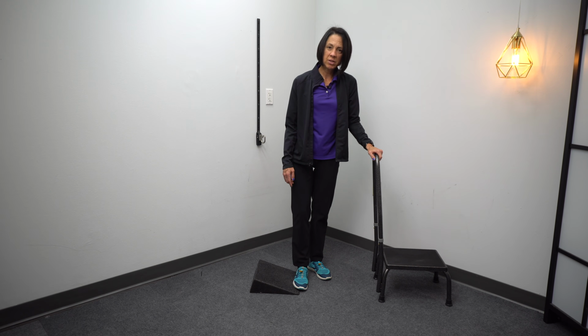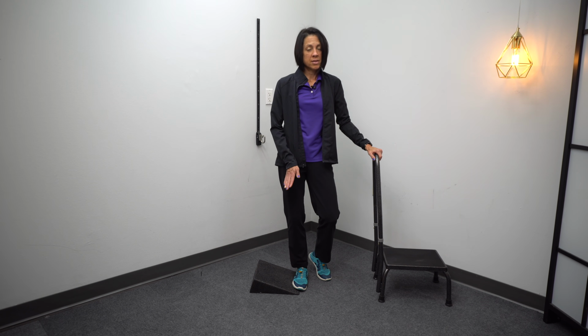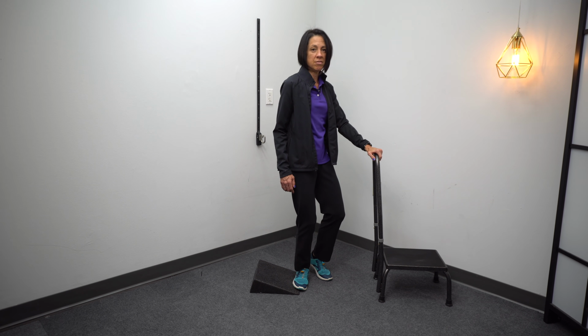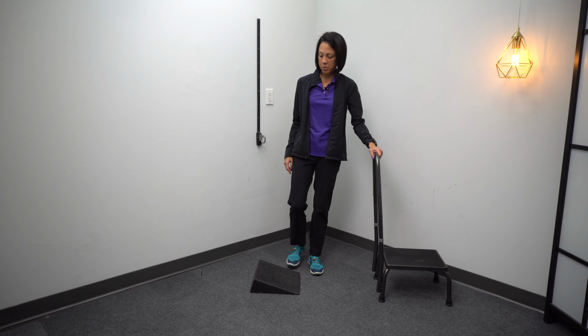But if you just have a little bit of a lift on the outside of that foot, and your knee stays neutral, then that's really where you want to stop. You don't want to go to a point where your knee is caving inward. Okay, so that's stretch number 2 with this first tool that we're going over.